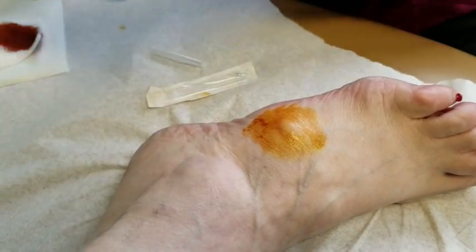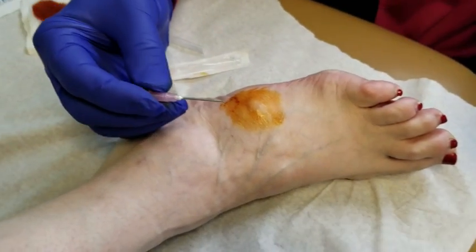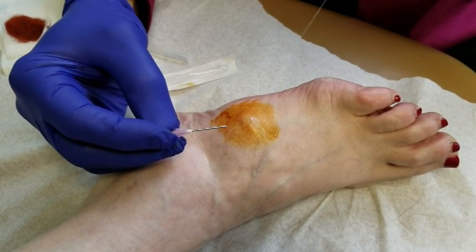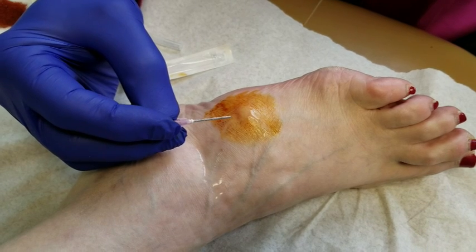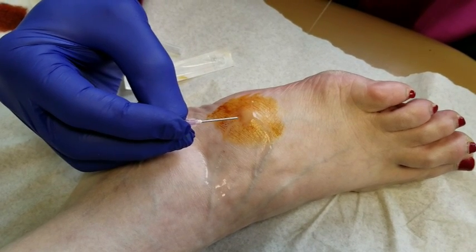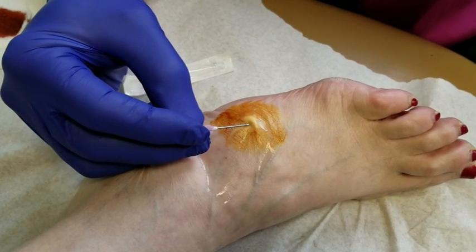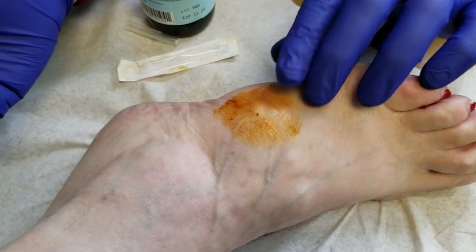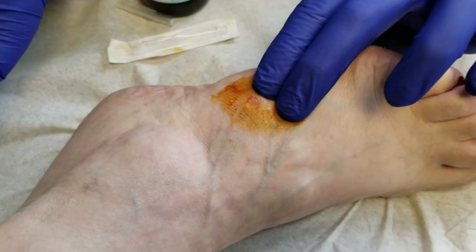We're going to go ahead and give her some cold spray here. This will numb the area of the skin — you'll see it frost over — and once it frosts over, we'll puncture it. Then you'll see the fluid come out.